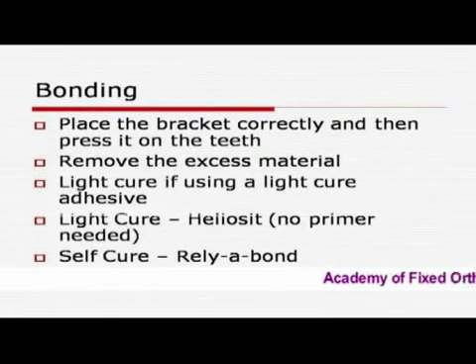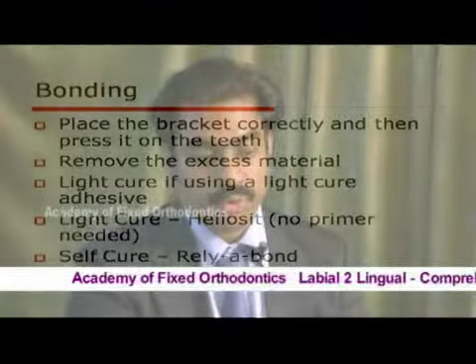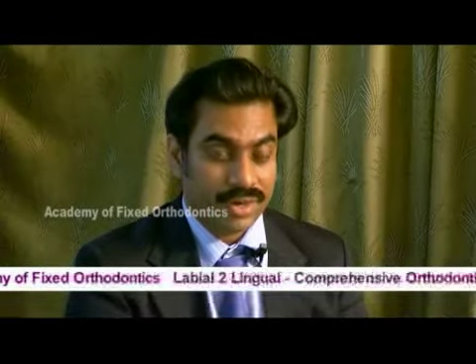Place the bracket correctly and then press it on the teeth, remove the excess material, and light cure if you are using a light cure adhesive. What I use is Heliosit Orthodontic from Ivoclar Vivadent, and no primer is needed for it.